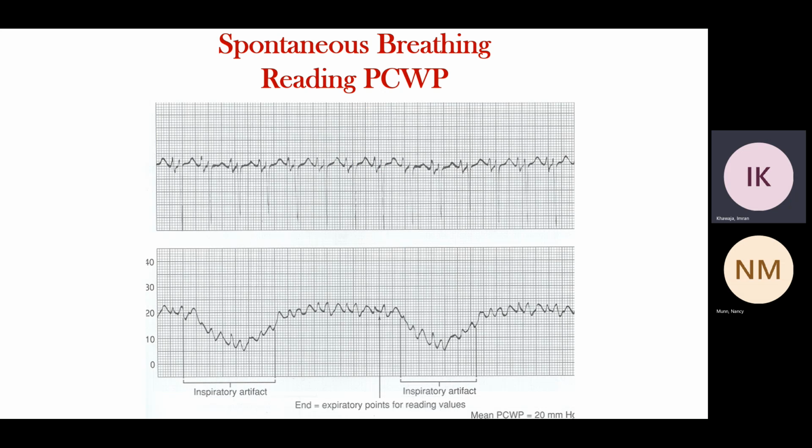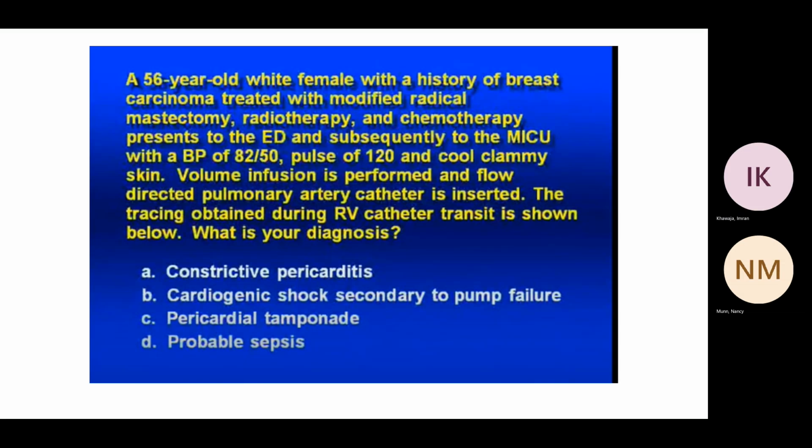We did talk about this, just showing you an example. It might show up. We said that your measurement should be at the end of expiration, in spontaneous breathing, and it will be the opposite of patients on the vent. So during inspiration, you see lower pressures here, so your measurement should be towards here at the end of expiration. Okay, go back to Hamza.